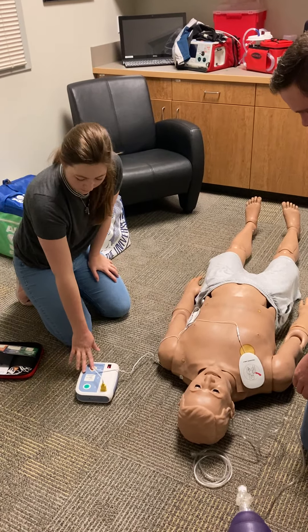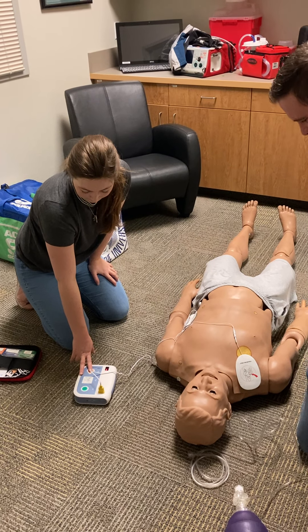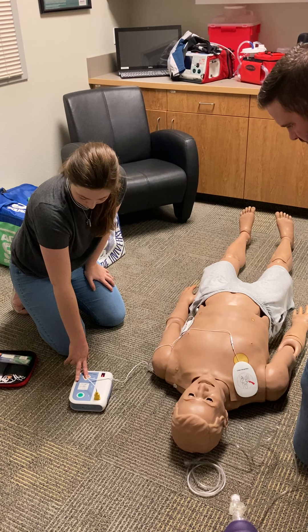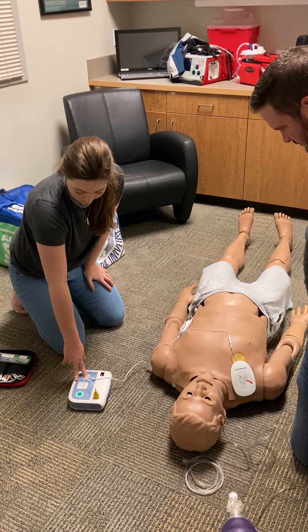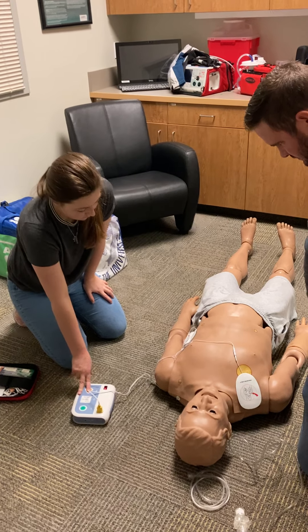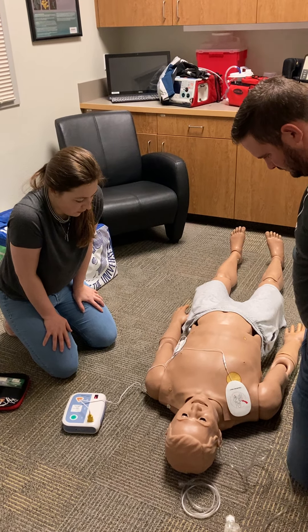1, 2, 3, 4, 5, 6, 7, 8, 9, 10, 11, 12, 13, 14, 15, 16, 17, 18, 20.